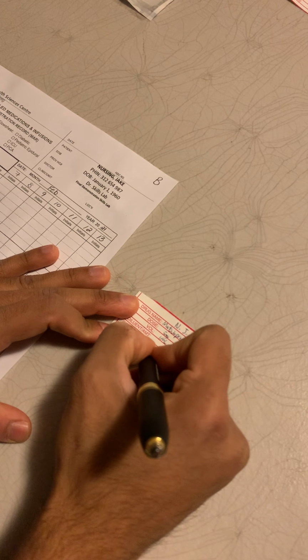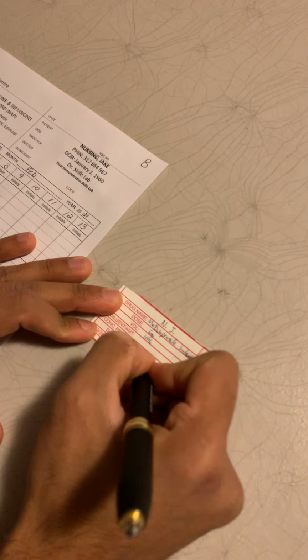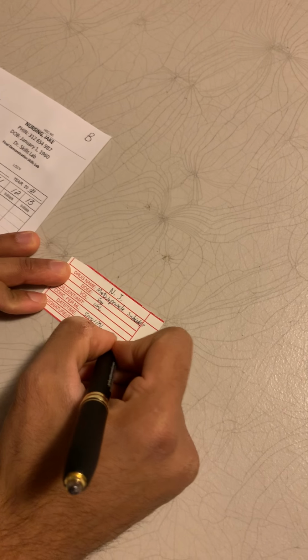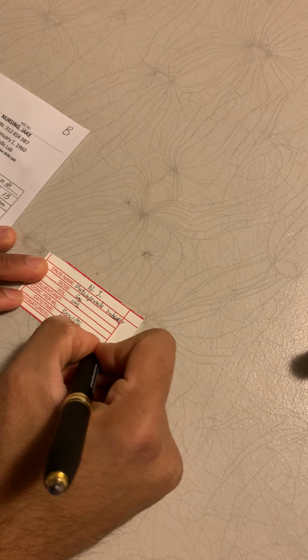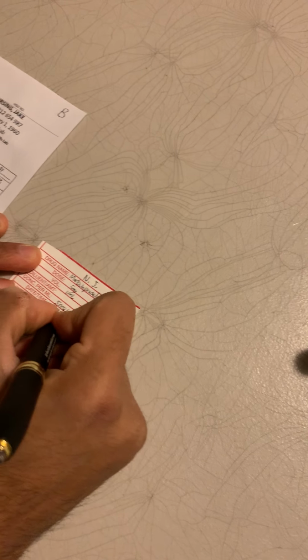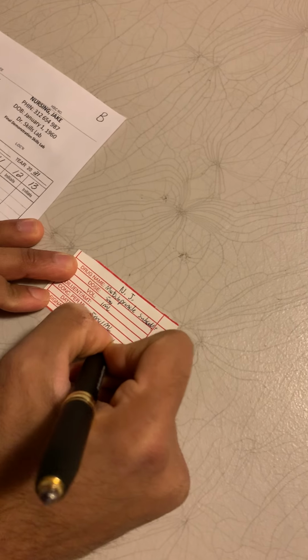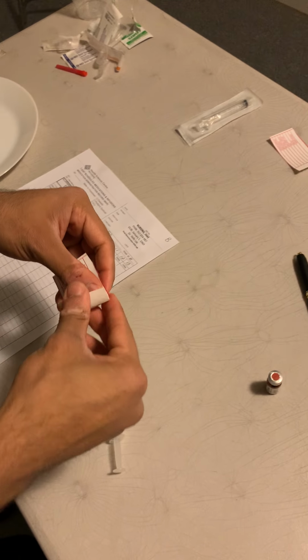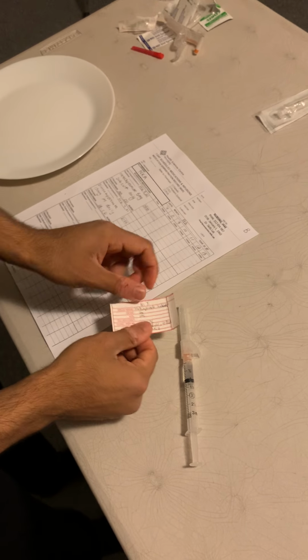Date and time is February 7th, 2021, 08/08/25. MKUMSN year 2. Okay, now I'm just going to be performing my second check after I put this onto the top of my syringe.